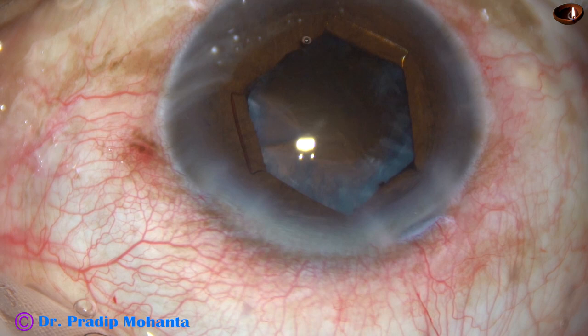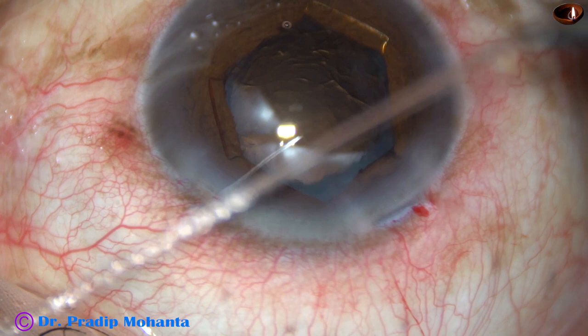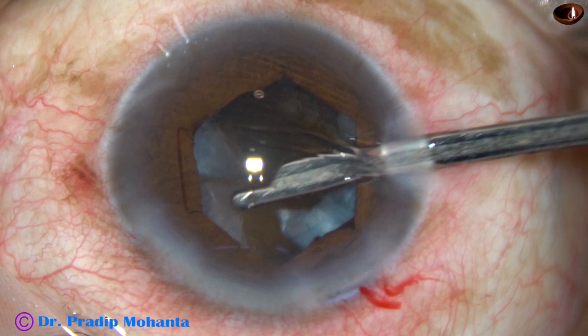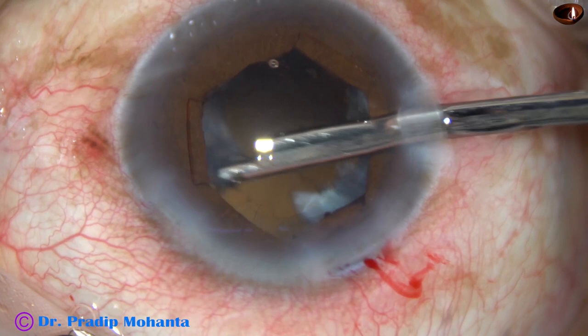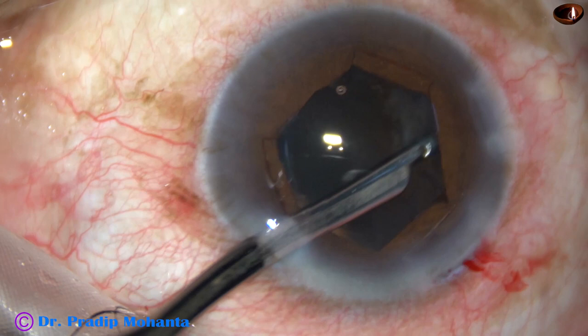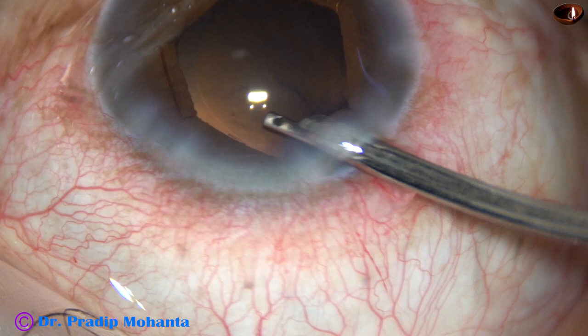Now I inject some visco and cortical cleanup is to be done. Going through the right side port and removing cortex from the superior aspect first. The cortex is coming very nicely with the help of this 23G Simcoe cannula. A 25G Simcoe cannula is also available nowadays. The cortex is cleaned very nicely.